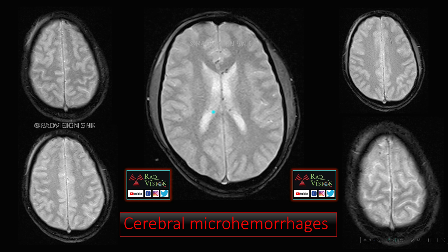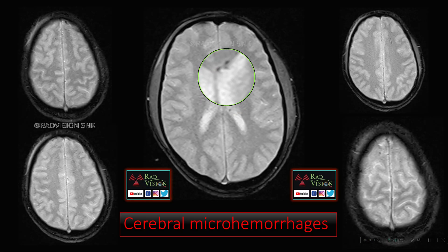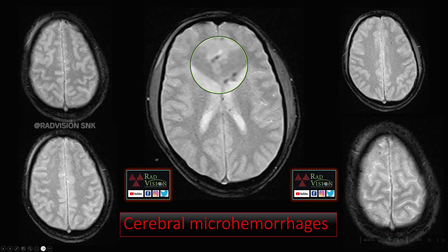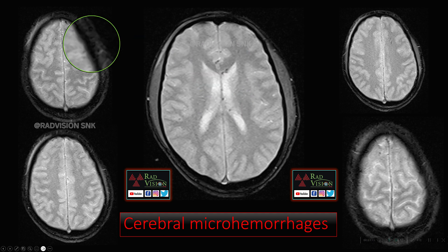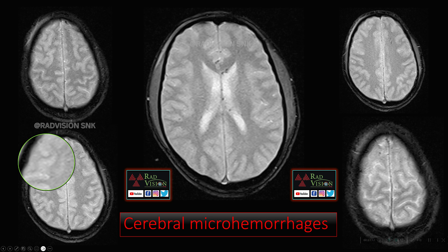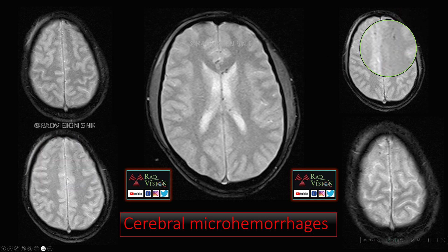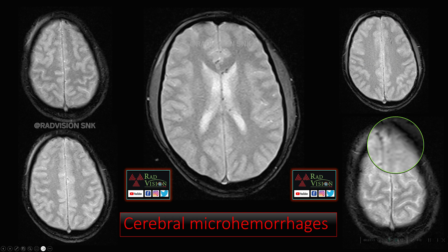There are tiny hemorrhagic foci — tiny microhemorrhages — which can be seen in the periventricular white matter and in the subcortical white matter of bilateral frontal lobes. These tiny hemorrhagic foci are nothing but cerebral microhemorrhages, which are also seen in DAI. In the subsequent slides, we will see what are the other causes of cerebral microhemorrhages.